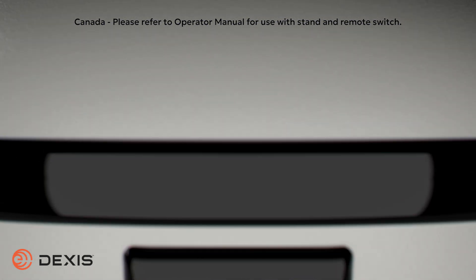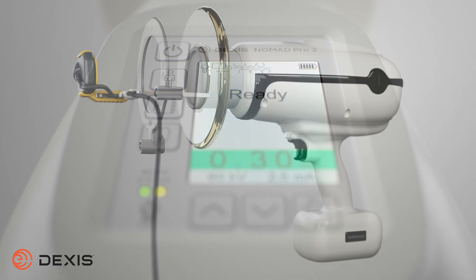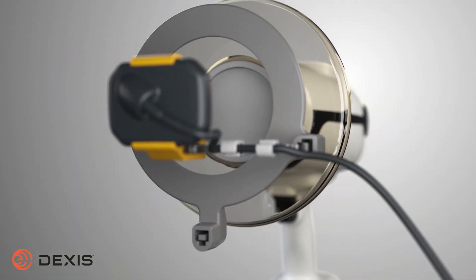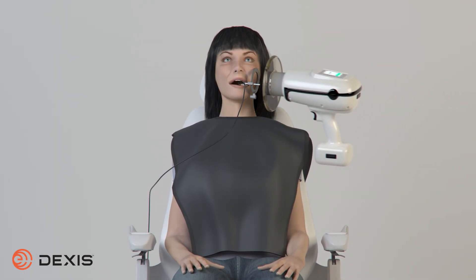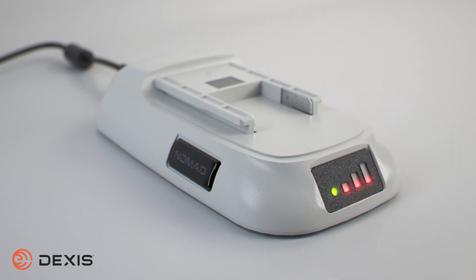Thank you for choosing the DEXIS Nomad Pro 2 as your x-ray solution. The purpose of this video is to educate you on techniques for safe handling of the Nomad for you, your patients, and for the public. This video is intended as supplemental training to your manual. It is also advised to take the operator's exam, included in the training materials.